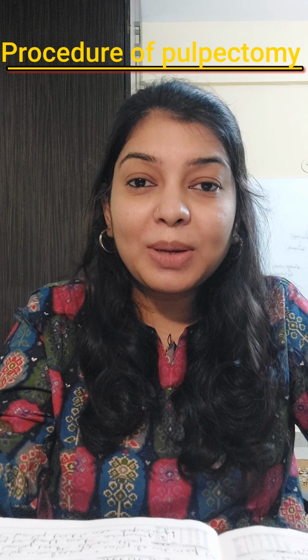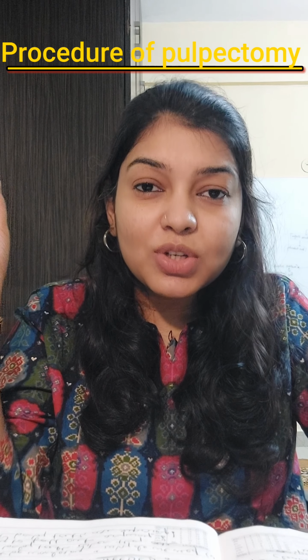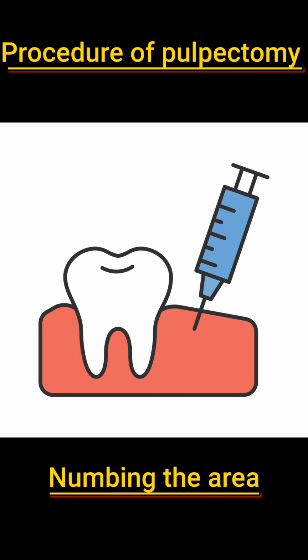So what happens during pulpectomy? Let's break down this procedure into simple steps. Step number 1, numbing the area. The dentist is going to numb the tooth in question and the area surrounding it with the help of local anesthesia so that your child won't feel any pain during the treatment.